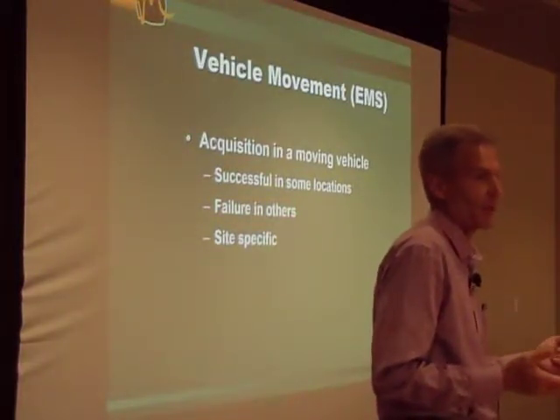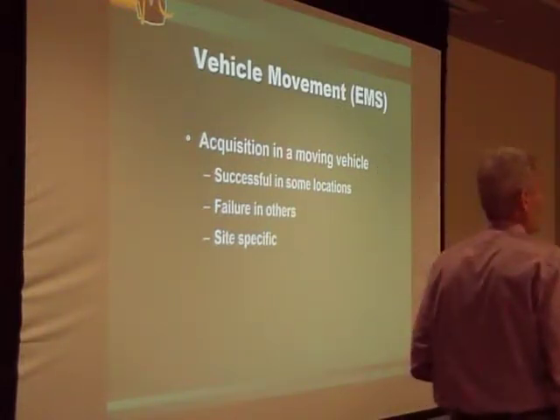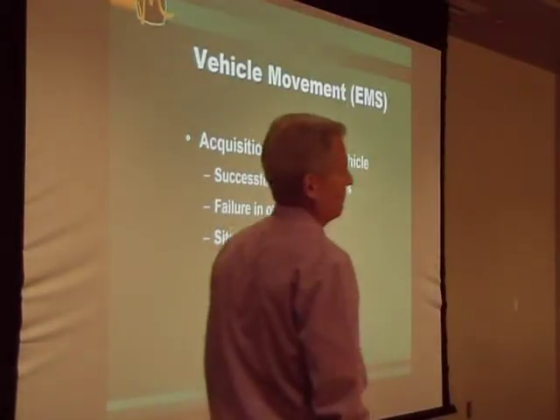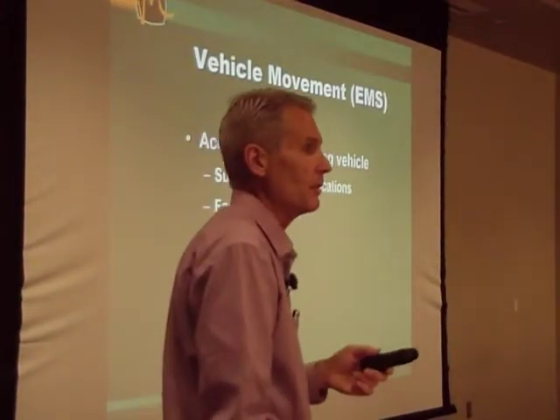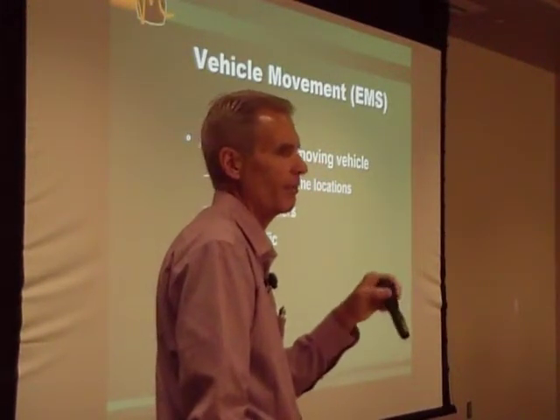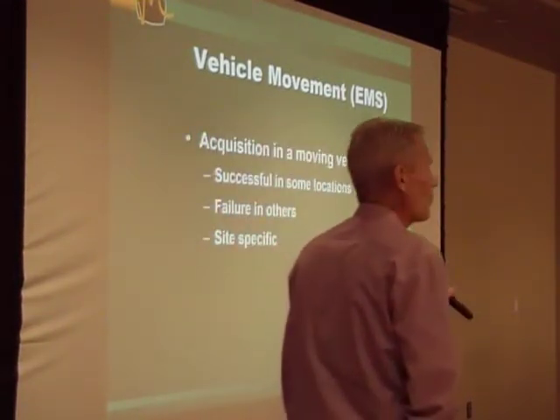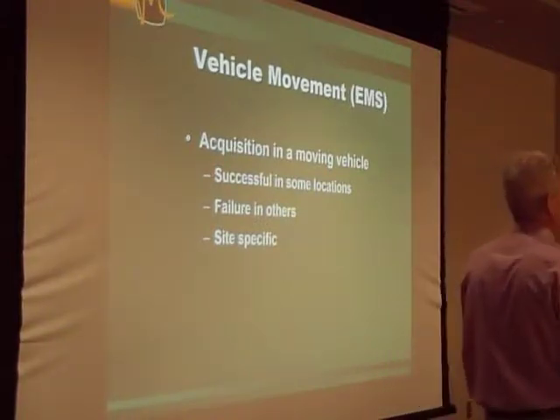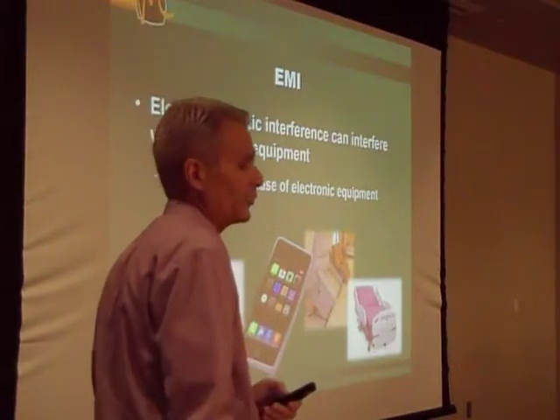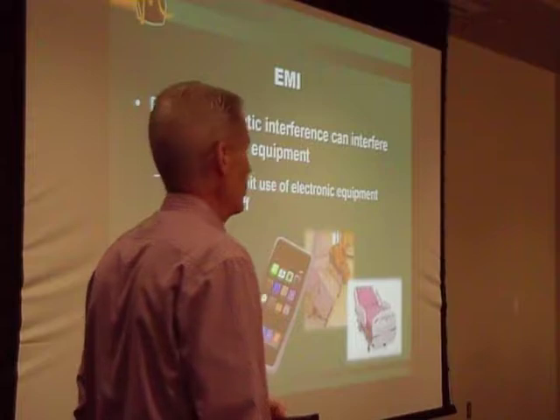Sometimes, if you're on a nice stretch of highway, nicely paved, not too bad. If you're on a road with a bunch of potholes, bouncing up and down, you might as well forget it. I don't know if you know this, but the pre-hospital devices that you carry actually have built-in filters for excessive movement. They're built that way, but they don't always work depending on the roadway that you're on. And then think about electromagnetic interference. Interference from anything that might be surrounding your patient.